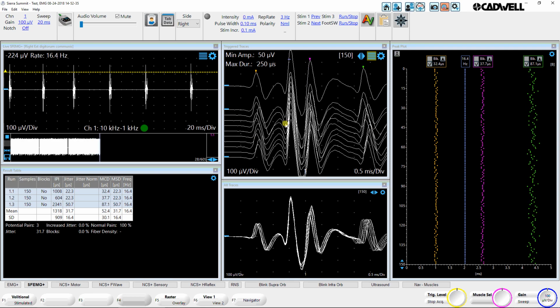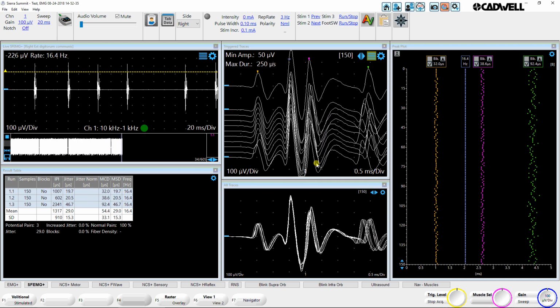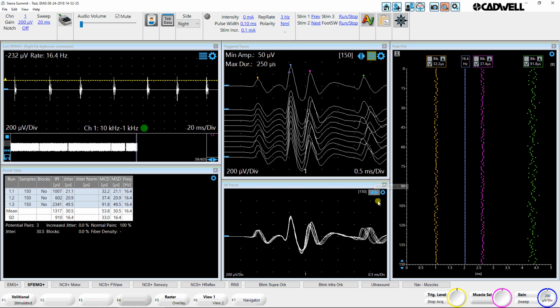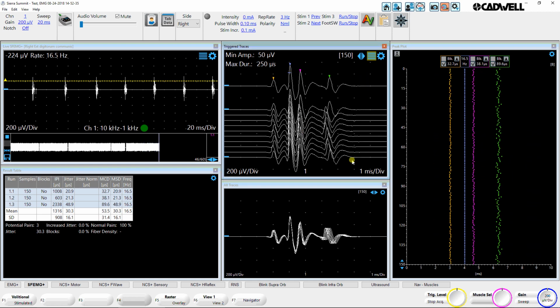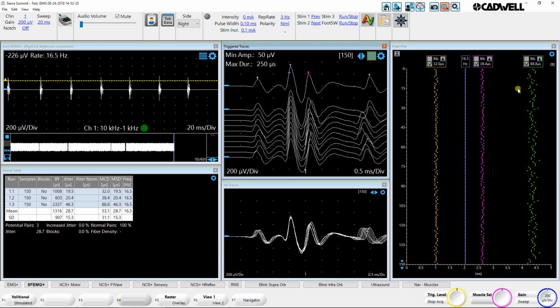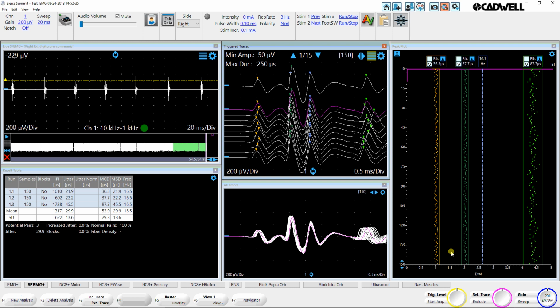And then in our trigger traces window, you'll see that motor unit displayed along with all the peaks that we are automatically detecting. We can use the blue knob to turn down the gain if we want to. The sweep can be changed by pushing down the blue knob, or actually for this window we could just increase or change the sweep that way to make sure we're getting all the peaks. So here we're seeing 4 peaks cascading down, and we have at least 150 samples of each, so we'll go ahead and stop that acquisition. Just hitting the switch, the yellow knob, or the run stop.